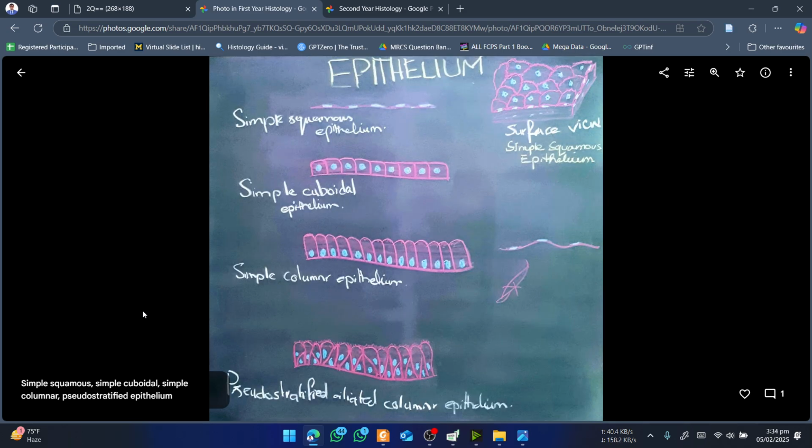Surface epithelium is simple or stratified. Simple has one layer, stratified has multiple layers. In the simple one there is squamous, totally flattened; cuboidal, cube shape, both sides equal; columnar, one side longer than the other; and pseudostratified. It means that it is actually a single layer, but the cells are of different sizes, so they don't seem to be at the same level. In the cuboidal, you usually cannot see the cell membranes, but the nucleus will help out.